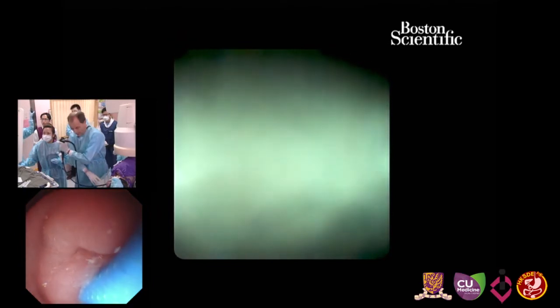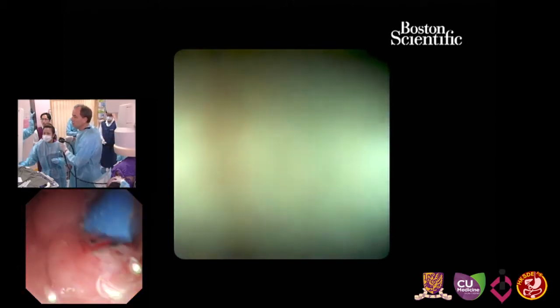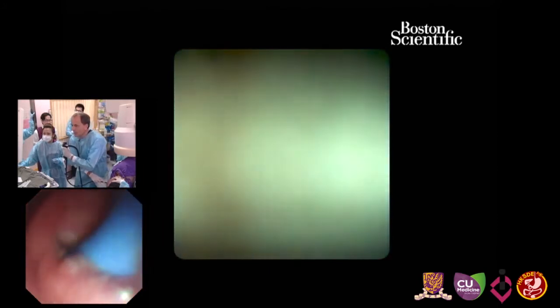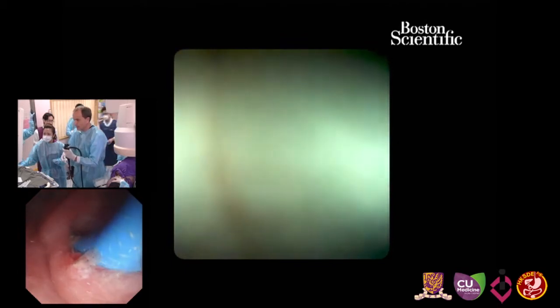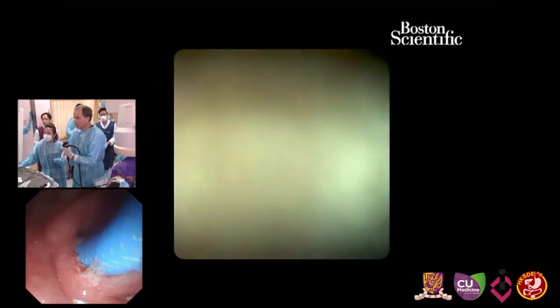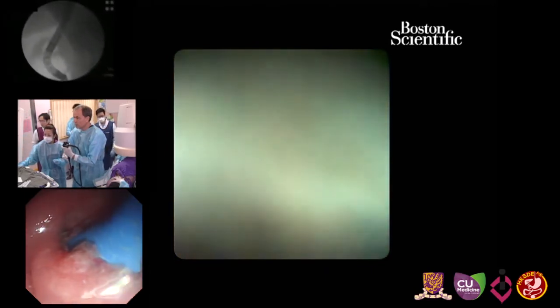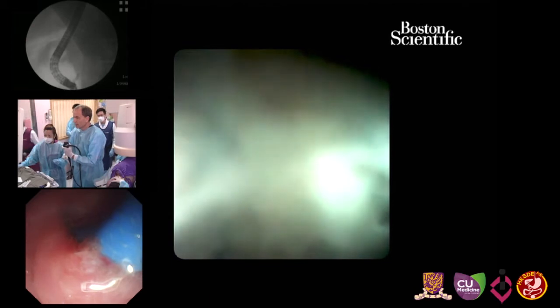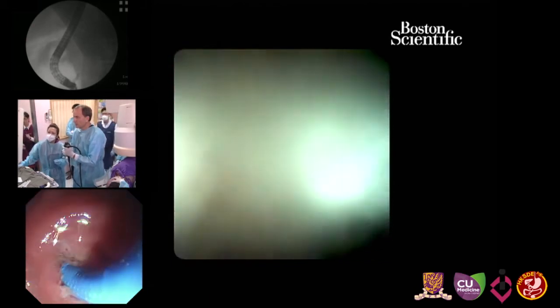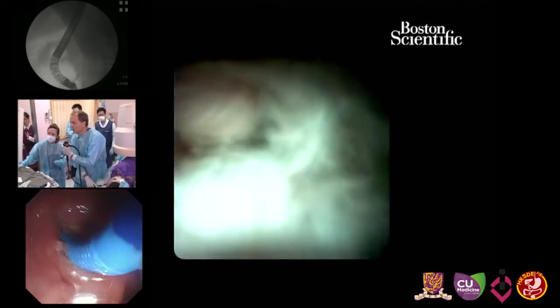When we also perform cholangioscopies and lesions are very close to the ductal orifice, then it's sometimes quite difficult to manipulate, in particular because the duct makes an angle here. So as you can see, I can nicely maneuver the tip, but we are still just in front of the wall. Now we see some whitish material coming closer.